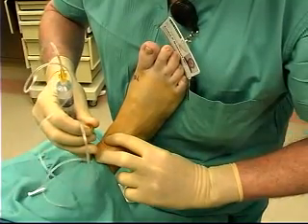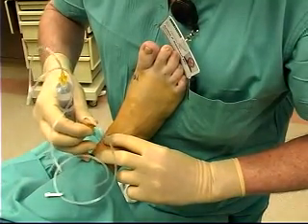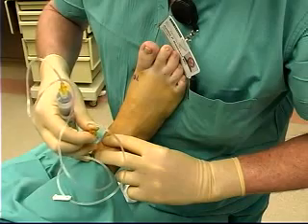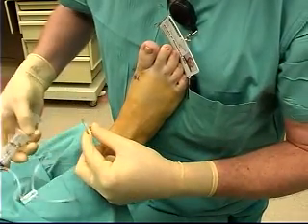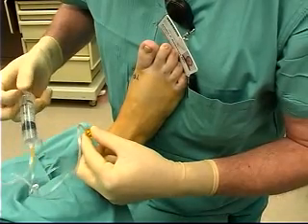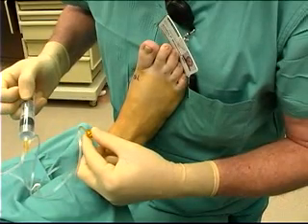A 25-gauge needle attached to a syringe with local anesthetic agent is inserted between the tendons of the anterior tibial muscle and the extensor hallucis longus until it encounters the tibia. It is then slightly withdrawn, and 3 to 7 milliliters of local anesthetic agent is injected.